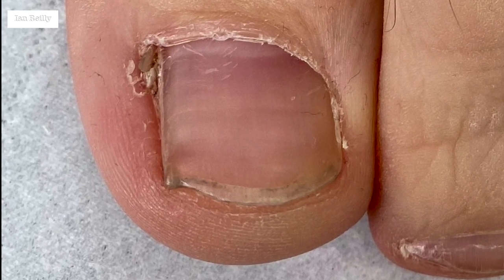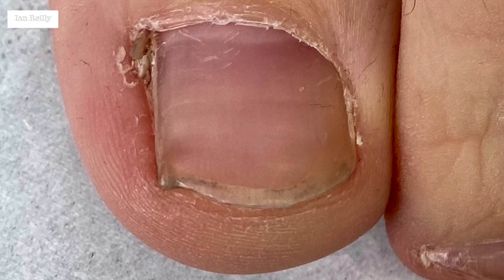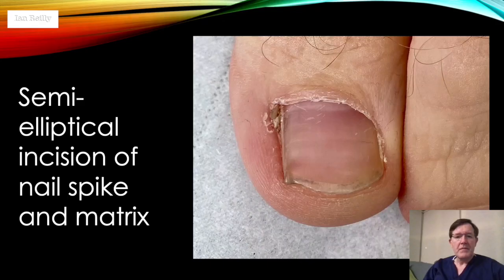We've decided that a spiculectomy rather than phenol was best. We'll take that section out and start off by doing a straight cut following the side of the nail, but coming far enough proximally that you're going to catch the most proximal end of the root, and then coming round the side in a semi-elliptical fashion — far enough mesially so you catch all of that nail matrix. You take that section out and go all the way down to bone.